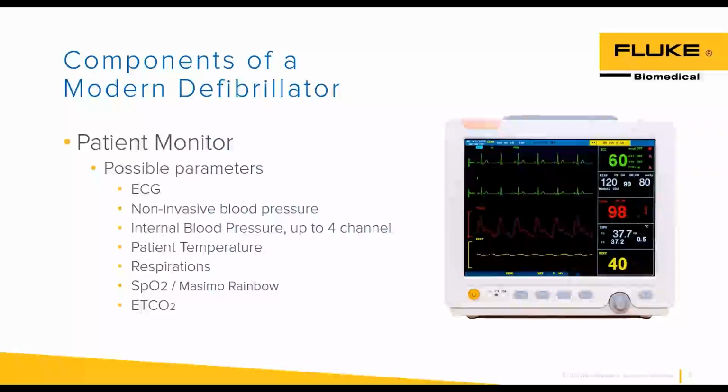So do me a favor, if you have any of these advanced defibs out there, check and see if it's just Masimo or if it's the Masimo Rainbow technology, and then see if you have the appropriate tools to test that.